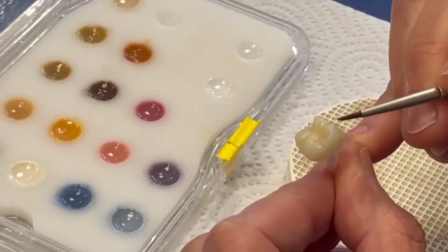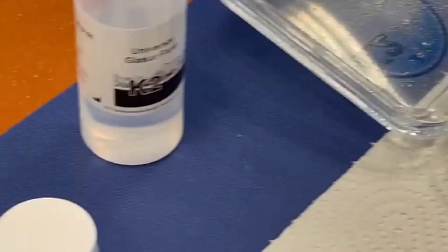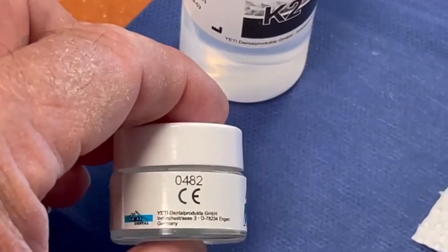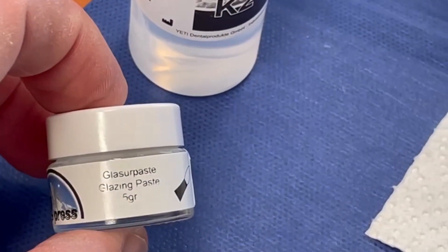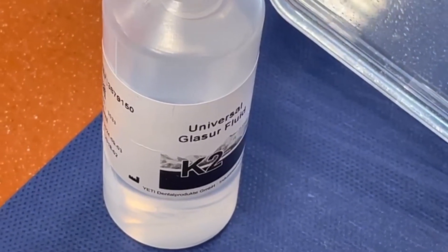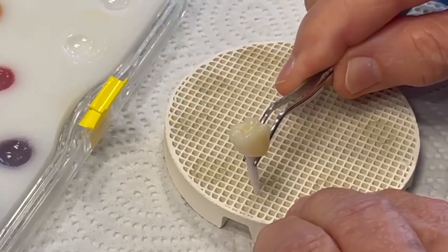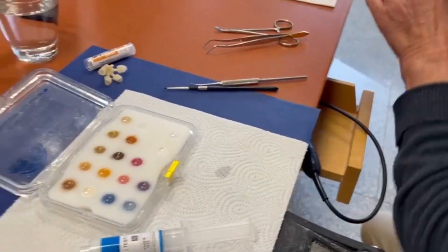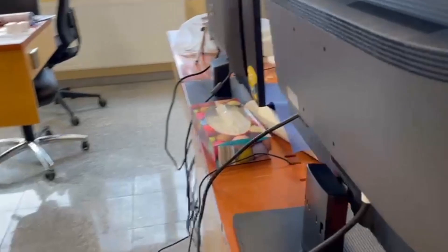On the crown, the glazing paste — as you can see here — is the 5 gram glazing paste. Or if you want to make it more liquid, you have the glazer fluid. We set it on the tray and now we go over to our furnace.